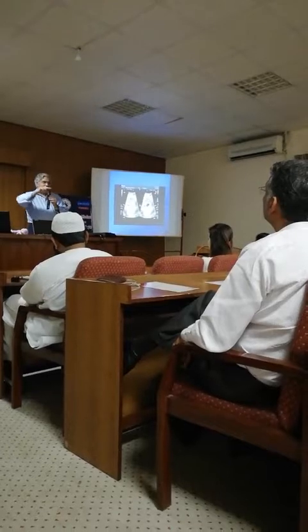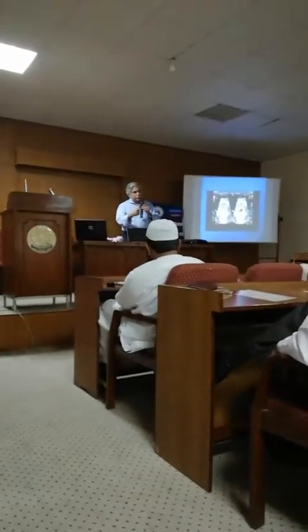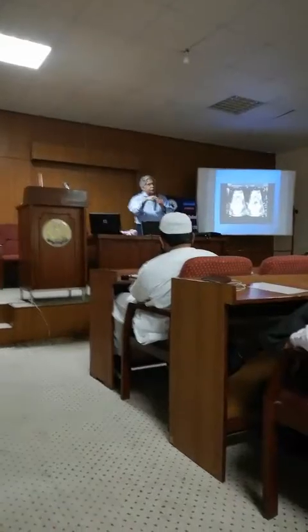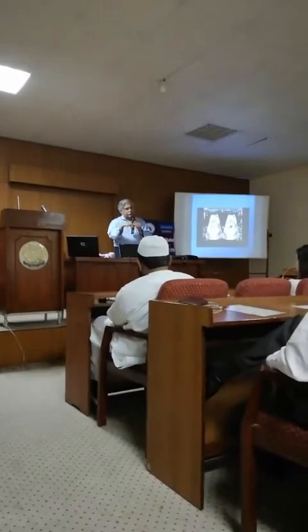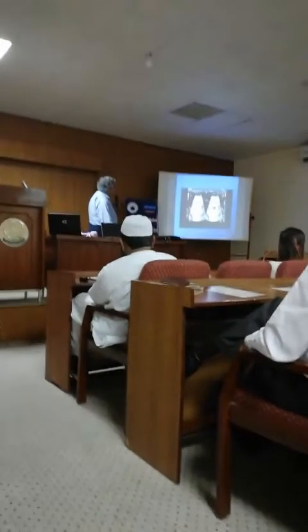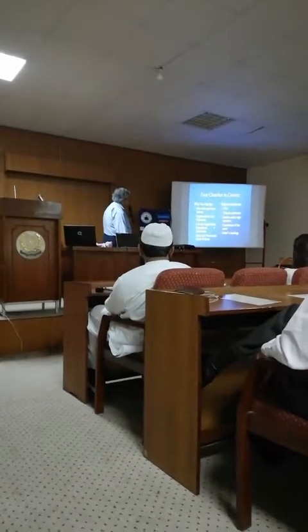You know, there is an echogenic upwards projection that appears as if the mitral valve and the tricuspid valve are at the same level. But you need to recognize where the crux is finishing and the anterior mitral leaflet is beginning. So you can do that. I'm sorry, there was supposed to be a video here, which is not working.